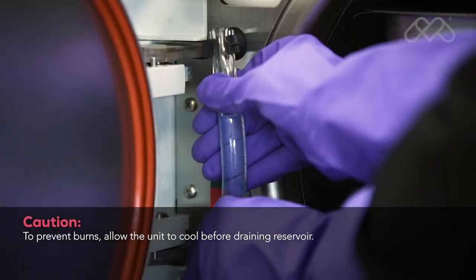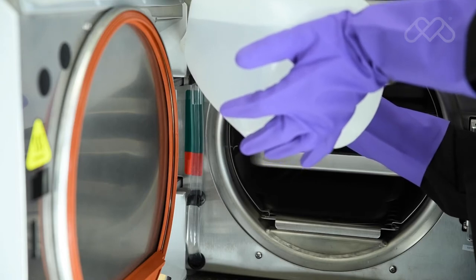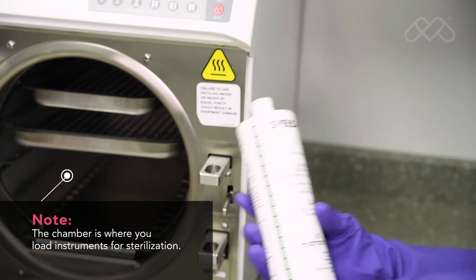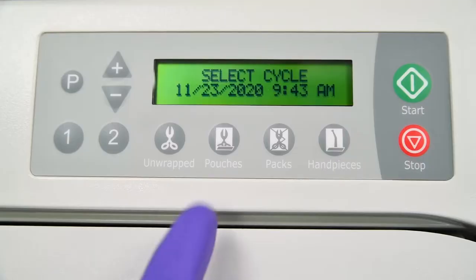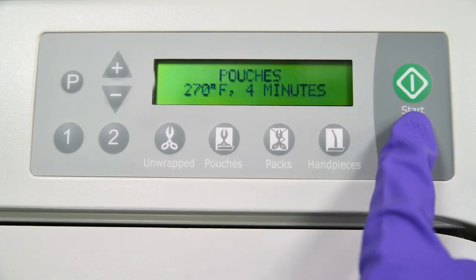With a cool chamber, drain the sterilizer reservoir and refill with clean distilled water. Add one ounce of SpeedClean sterilizer cleaner directly to the cool chamber. Run a single pouches cycle, but press the stop button when the drying cycle begins.